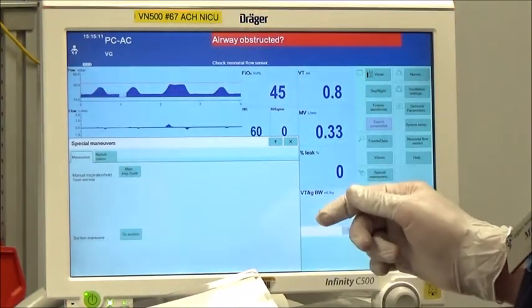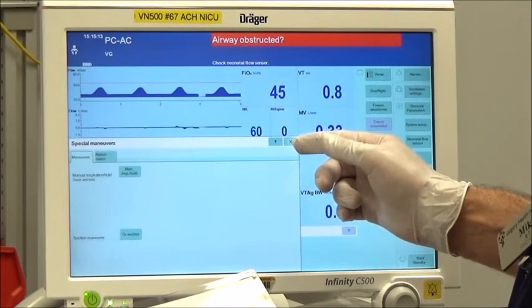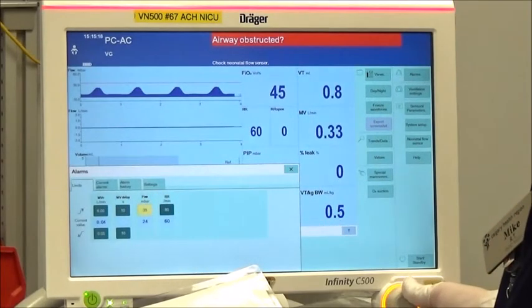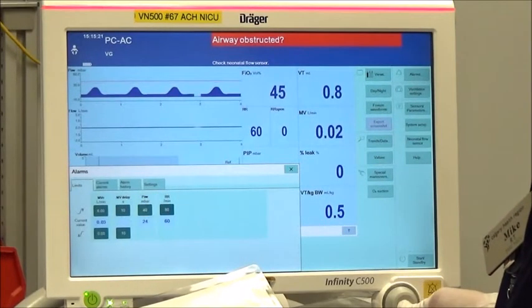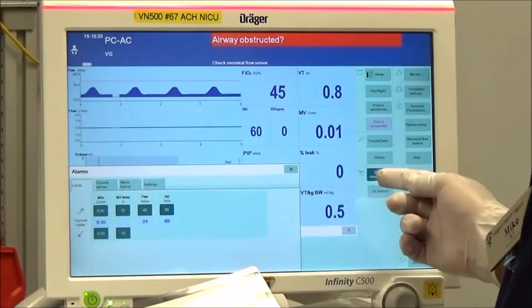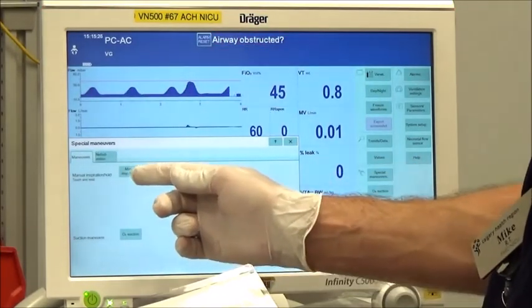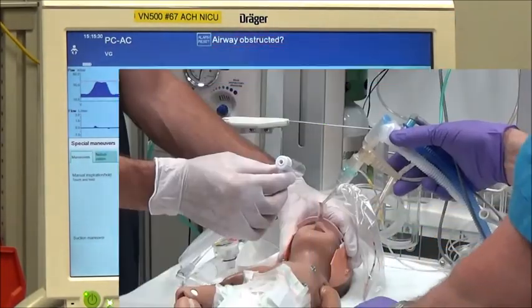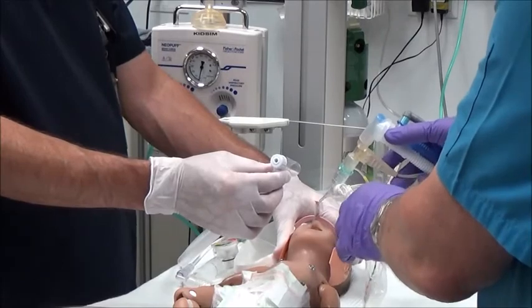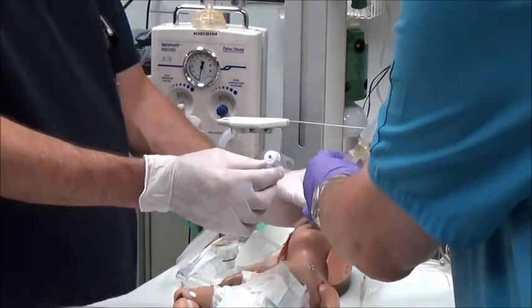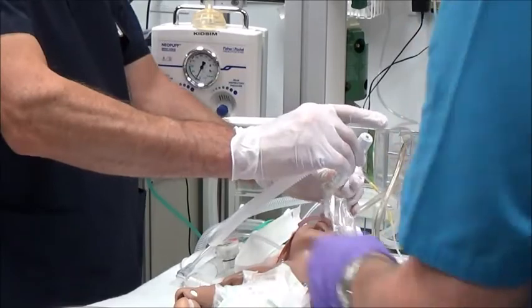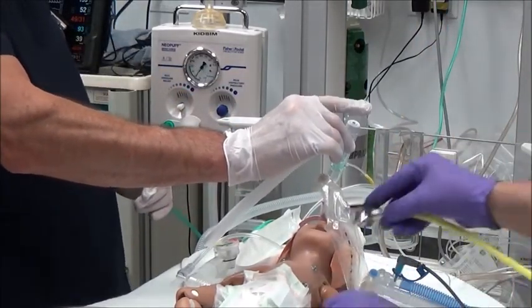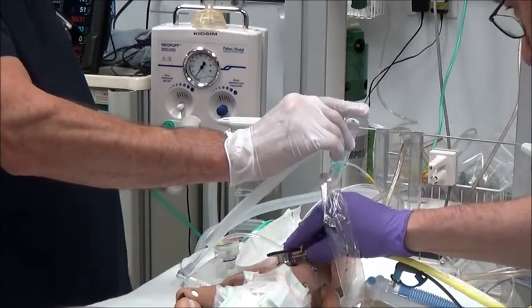If manual breaths do not re-establish effective ventilation, increase the high pressure alarm to 40 cm of water and provide three manual breaths. If ventilation is still not re-established, disconnect from the ventilator and provide ventilation with the Neopuff resuscitator. Initial pressures should be 40 cm of water pressure over 6 cm of water pressure.